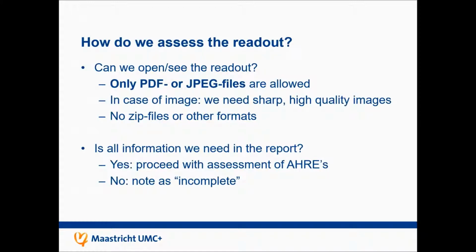Okay, how do we assess the readouts? Well, we get the readouts after you uploaded them in the MAUIN database, and it's very important to point out that we can only open and see PDF files and JPEG files, so only PDF and images. So when you scan or photograph a readout, that's not a problem, but it has to be in JPEG or PDF. And in case it's an image, when you make a photograph or a scan of it, it needs to be sharp and in high quality, because I'll point that out later.